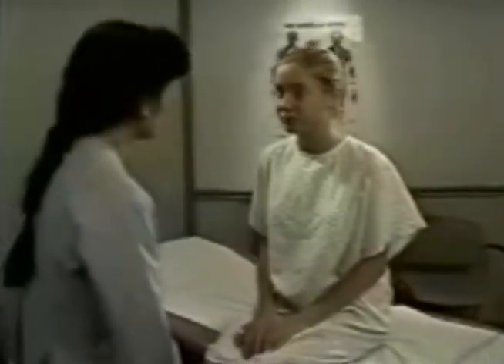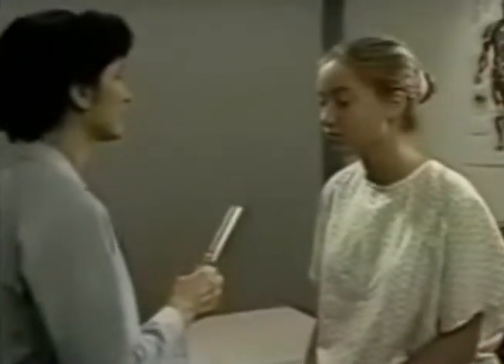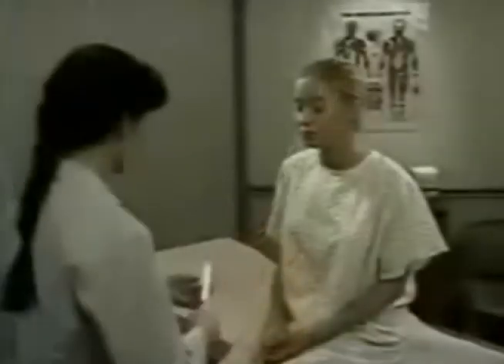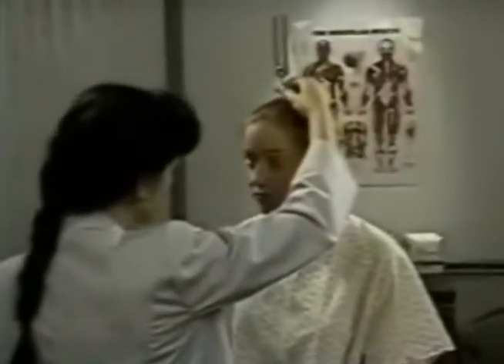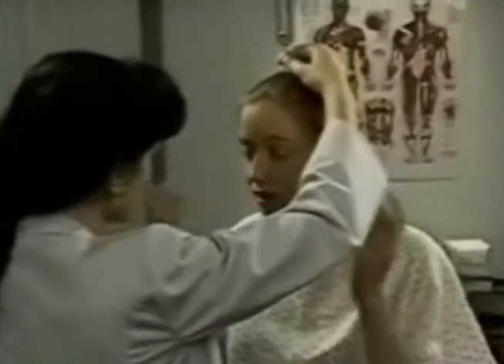If hearing is diminished, do the Weber test, which checks for lateralization of bone conduction, and the Rinne test, which compares air and bone conduction. For each test, use a relatively high-pitched tuning fork, such as one of 512 Hertz. To do the Weber test, place a lightly vibrating tuning fork firmly on top of the patient's head.